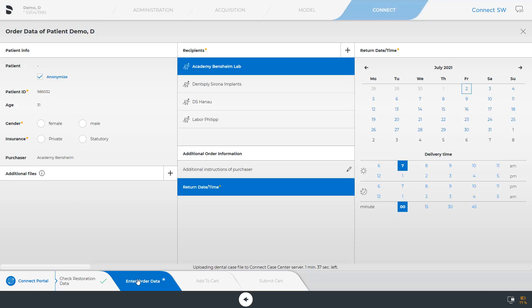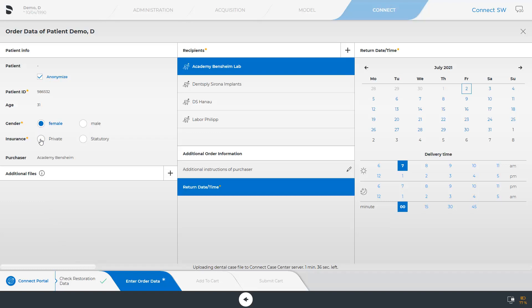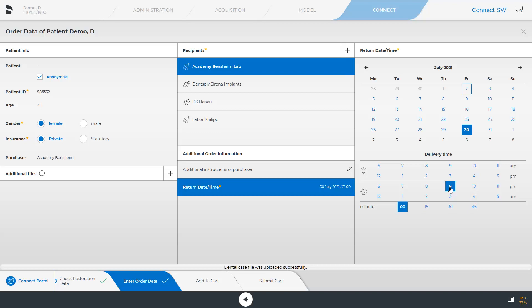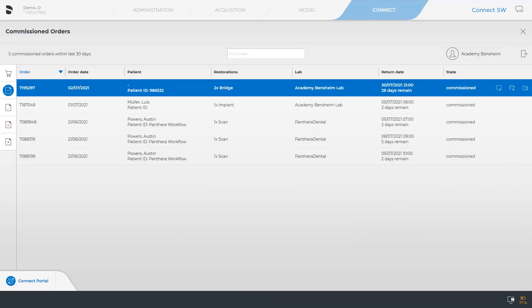Atlantis superstructures can only be ordered from your partner lab. Depending on the partner lab, this step can look different since the order information can be modified by the lab. All fields marked with an asterisk are mandatory fields which we will quickly complete. In the meantime, the case data have been successfully uploaded so that now we can transmit the case to the lab by clicking Submit Cart. The state shows that the case has been ordered.